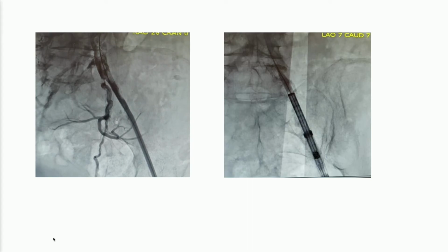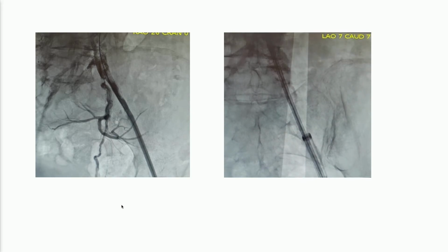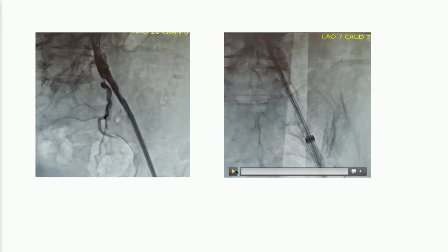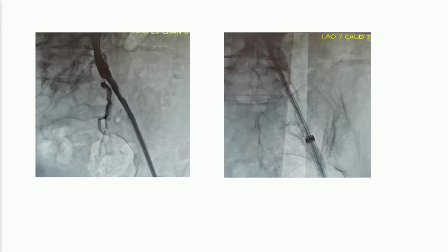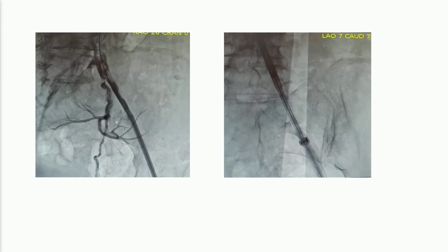You can see a bleeding now near the stent, in the proximal segment of the stent. And we decided, Pedro said, I saw your discussion before. At that time, I think that it is better to go to the valve and implant the valve, and we go very quickly to the annulus. We go with the CoreValve.